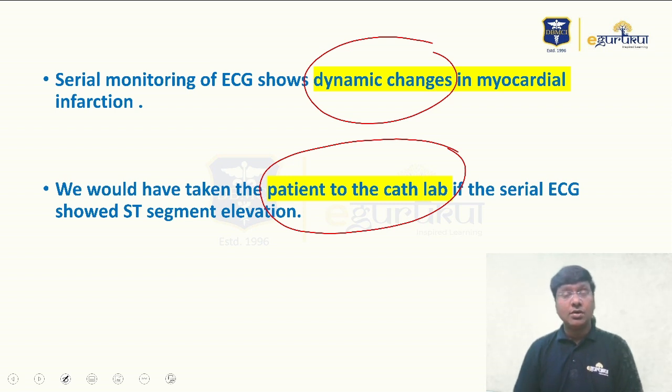So what is the take-home message? In early stages of MI, the ECG may appear normal. So what do you have to advise? You have to advise serial monitoring of the ECG. That is the take-home message from this session.